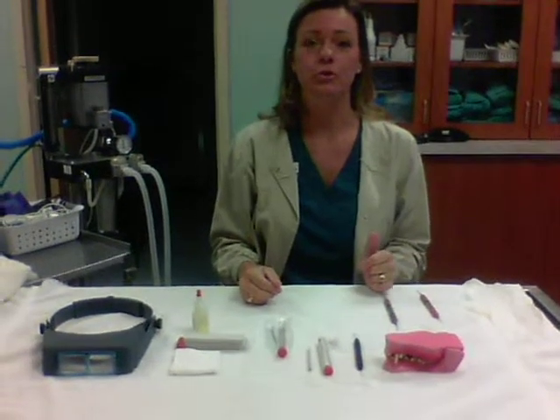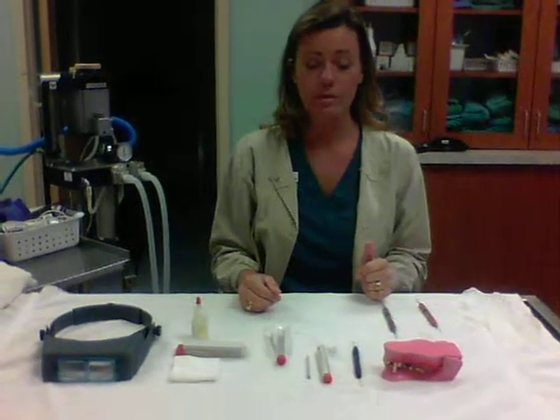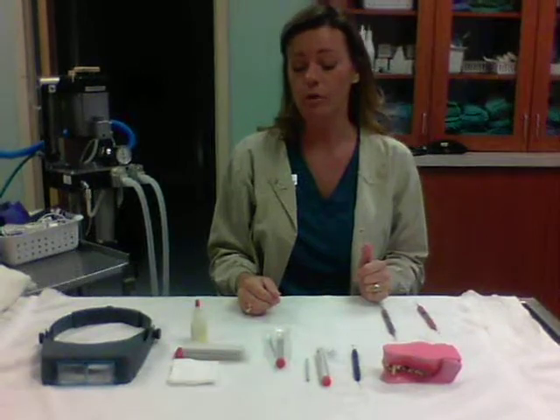Hi, this is Jennifer Fisher, student number 21106304, and today we're going over our dental hand instruments, how to sharpen them and their use.